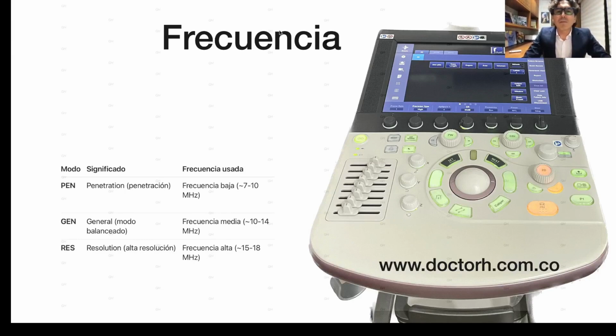So, the first fundamental parameter is frequency. On our machine, we had already shown where the command is, and it's this one. Normally, machines may have a knob where that frequency is managed by us, from one range to a certain range. But on our machine, it's already pre-configured.